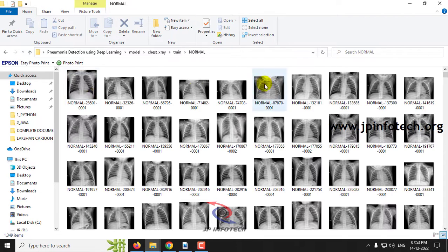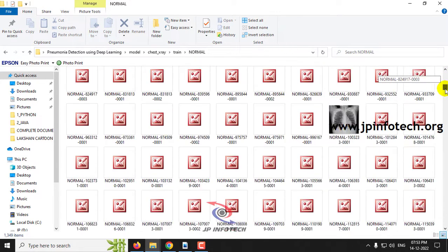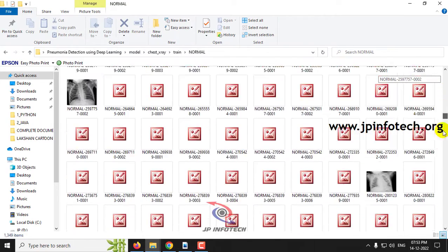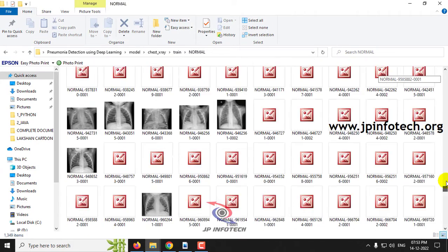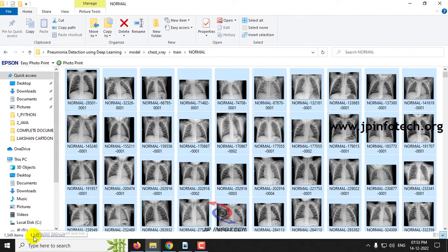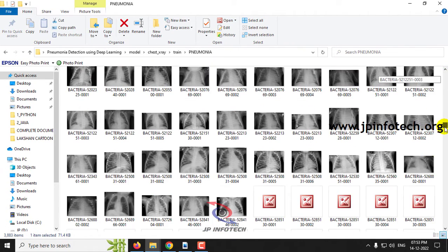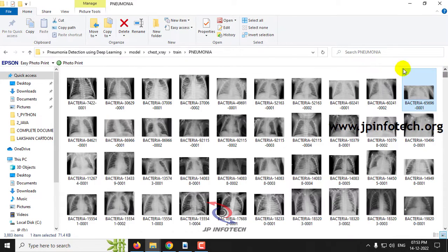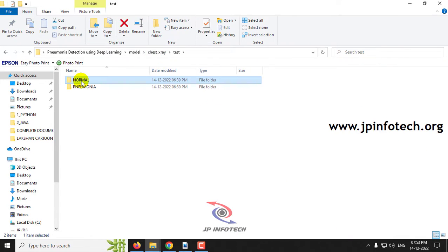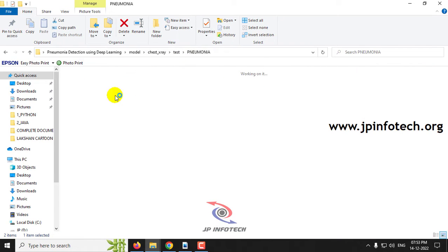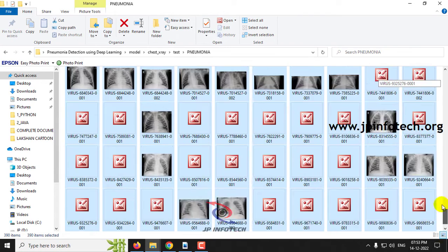In the train part, you can see the normal chest X-ray images — these are all the images available for the training part. As mentioned, there are around 1,349 normal images and around 3,883 pneumonia images available for training. In the test part, the normal images consist of around 234 images and in the pneumonia part we have around 390 images.